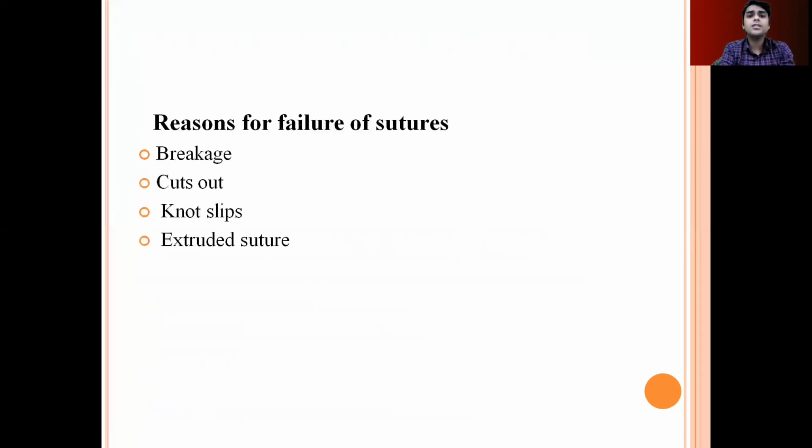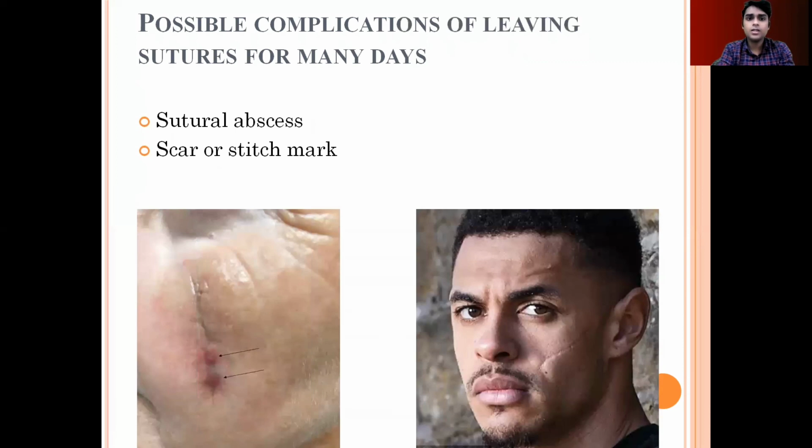What are the reasons for the failure of sutures? It includes breakage, cutouts, knot slips, and extruded suture. Some possible complications of leaving the sutures for many days include suture abscess or scar or stitch mark.